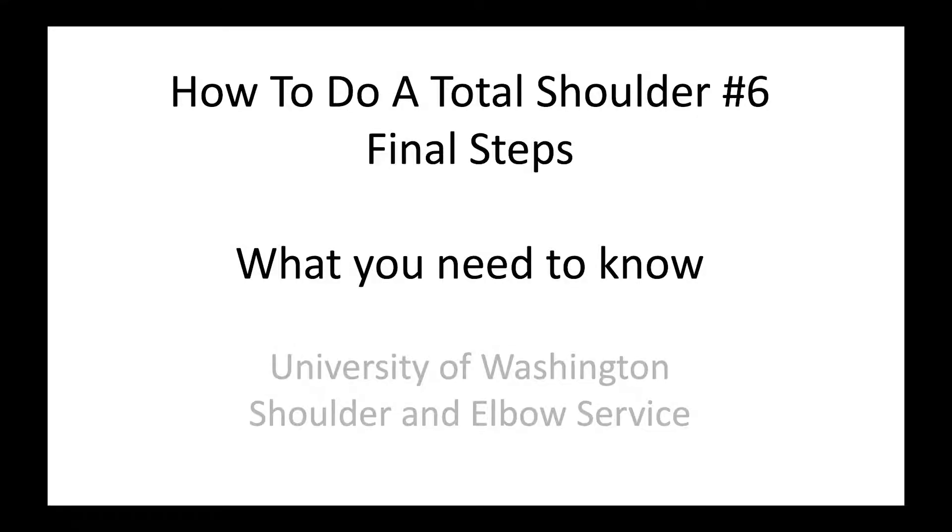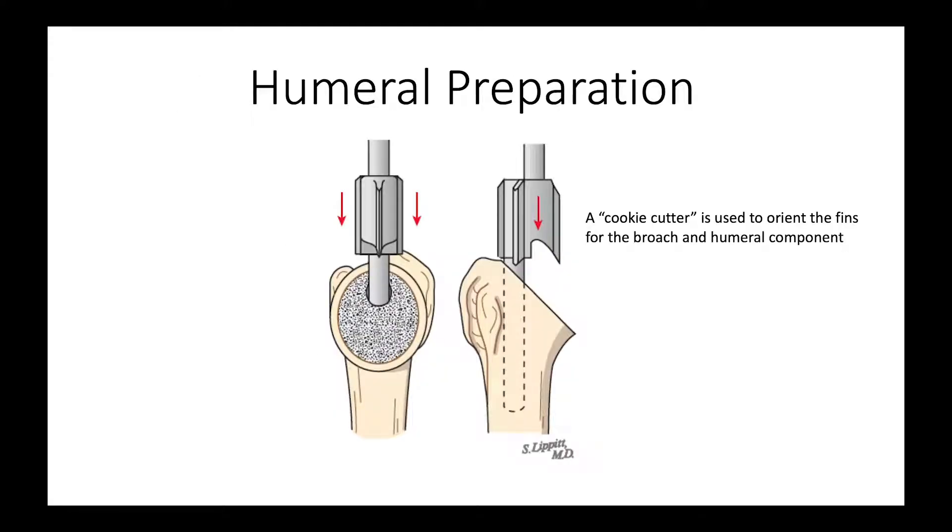This is Rick Mattson from the University of Washington Shoulder and Elbow Service. We're talking about how to do a total shoulder, and here are the final steps. We've got our glenoid component in position and securely fixed, and now we're going to finalize the preparation of the humerus.